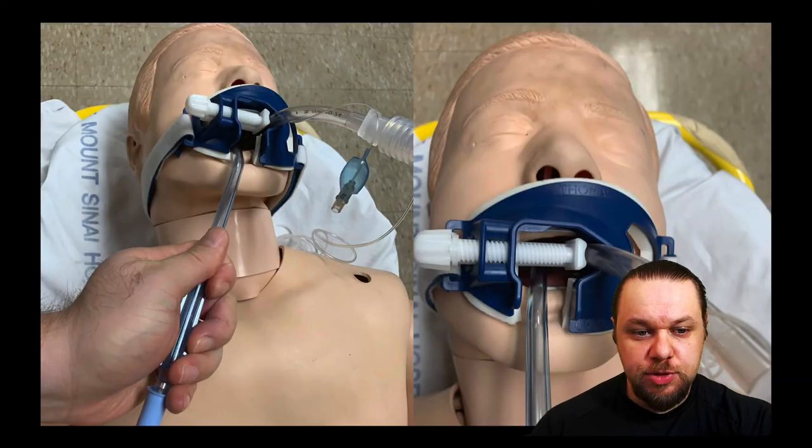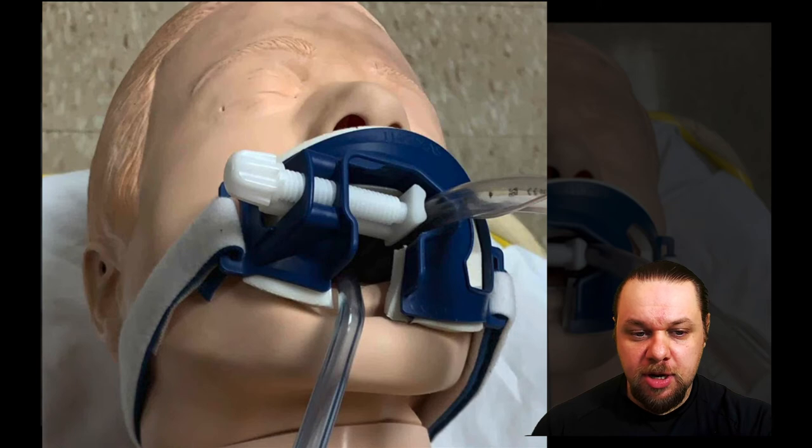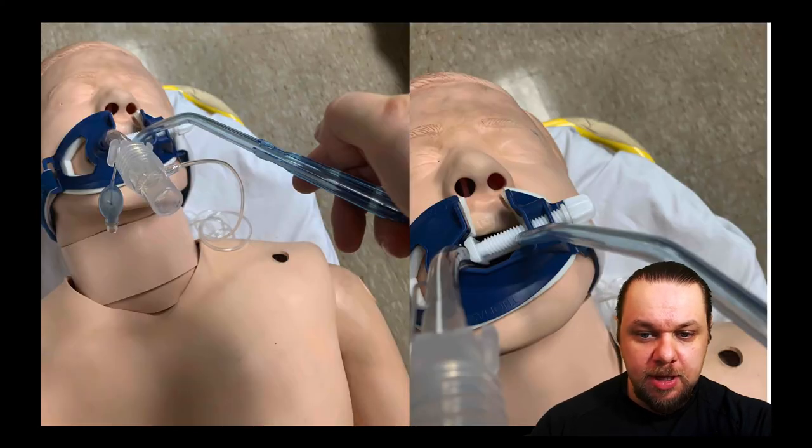Here you can see me using a Yankauer to suction the patient's mouth. With the Thomas tube holder placed correctly — mouthpiece aperture facing towards the feet — this facilitates easy entry of a Yankauer or tonsil catheter through the wide-bore opening, making it easier to suction the patient's mouth.